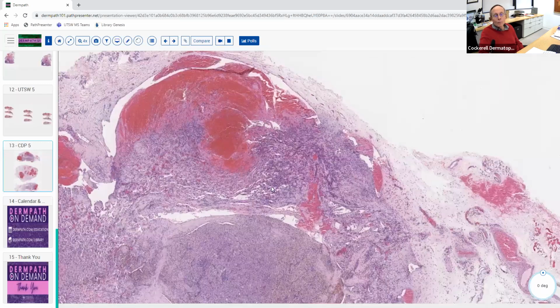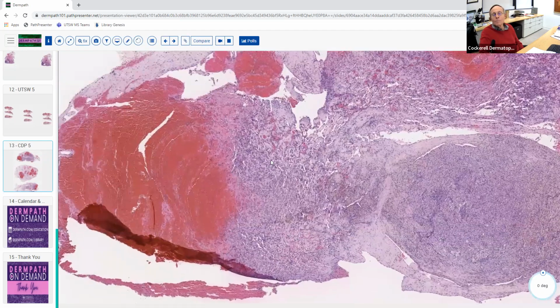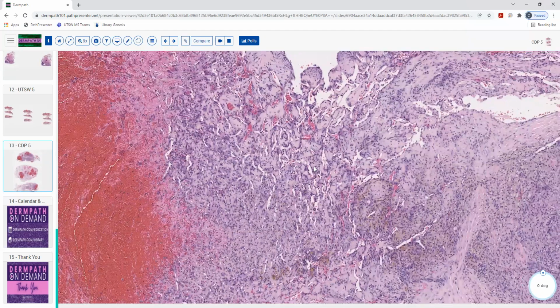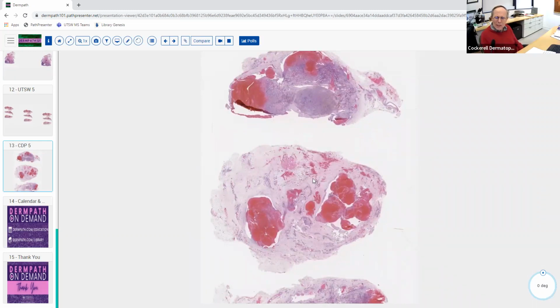So if they throw one of these vascular lesions on the exam and they put something like that in there for differential diagnosis, you're not going to fall for that. I was reading in Elston that Masson's tumor most often occurs within the angiokeratoma. Like it can occur elsewhere. I don't know. Is that true? We don't usually see Masson's inside an angiokeratoma. That would be pretty unusual.